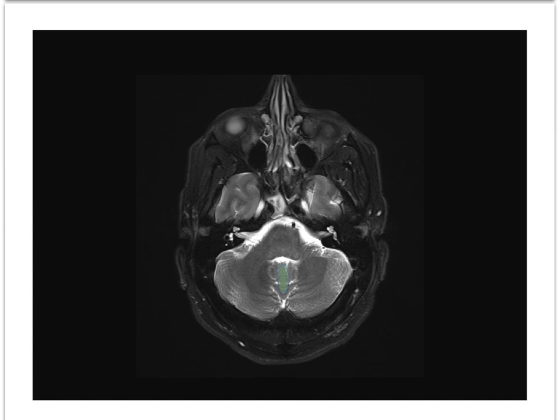Here is the vermis of the cerebellum in the posterior midline, flanked by the slightly darker dentate nuclei. Notice that the cerebellar vermis forms the roof of the 4th ventricle.